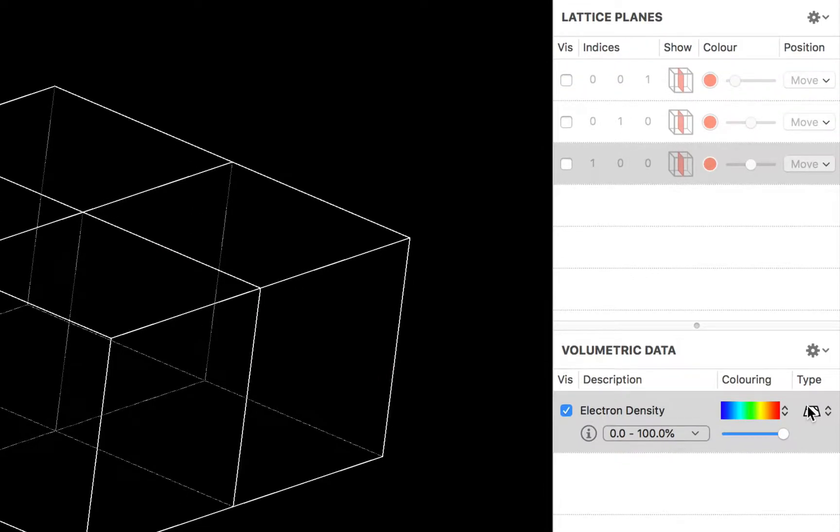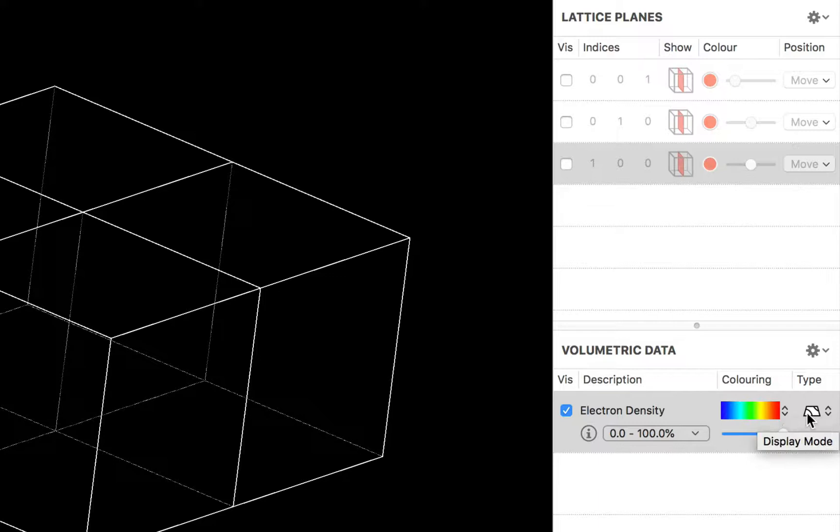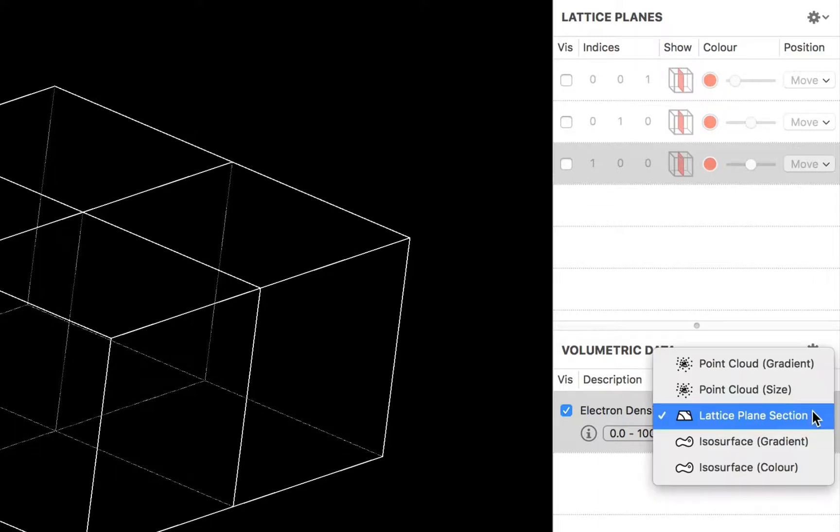Then we'll move down to the volumetric data group and we can see that we have a coloring scale and we have a type pop-up. And this lets us choose from different display modes. So one thing that you might want to do is to actually visualize the individual data points that are plotted on the screen.